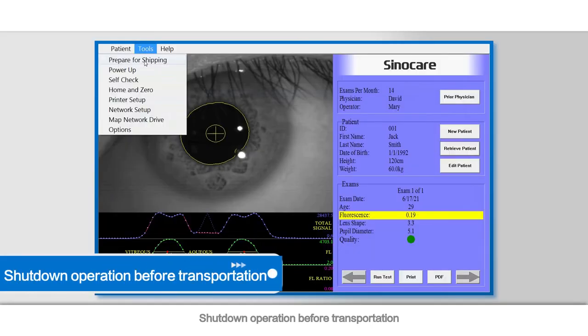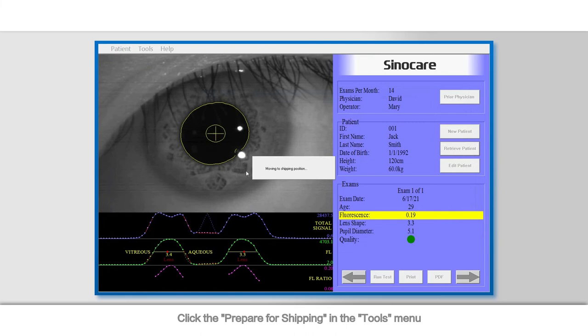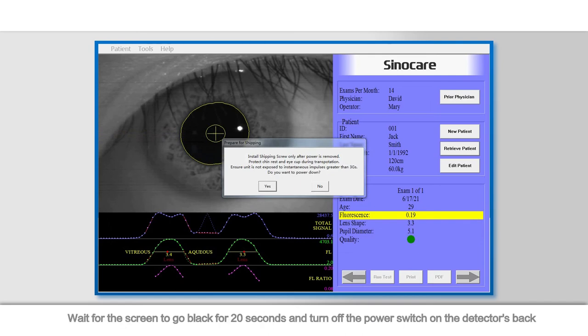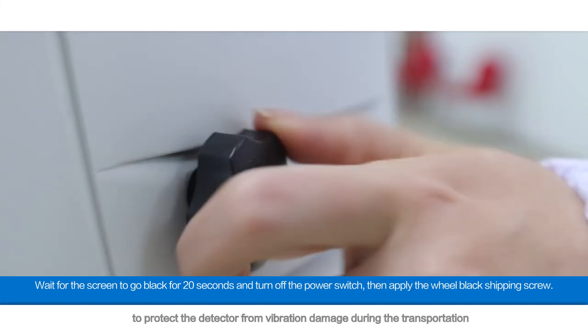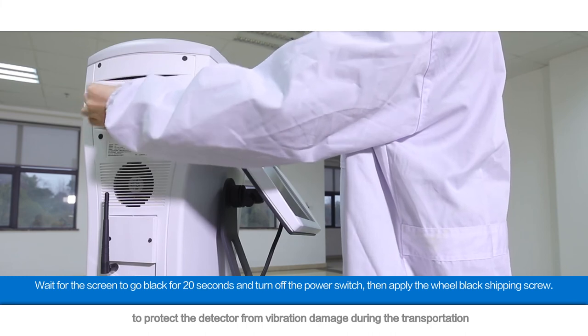Shutdown operation before transportation: click Prepare for Shipping in the Tools menu. Click Yes to confirm and the instrument will shut down automatically. Wait for the screen to go black for 20 seconds, then turn off the power switch on the detector's back. Manually screw in the black shipping screw into the screw hole on the back of the detector to protect the detector from vibration damage during transportation.